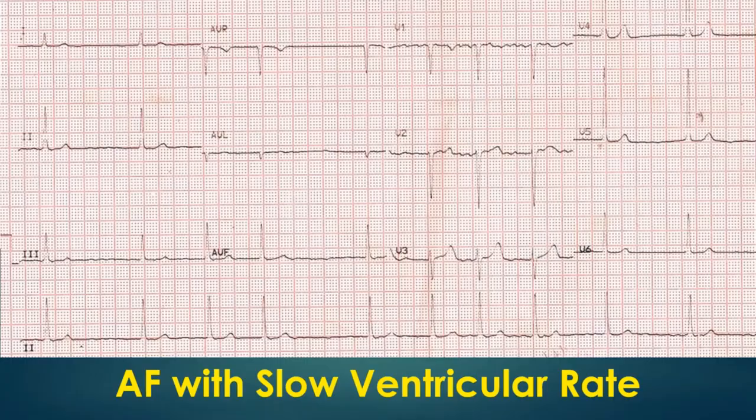Atrial fibrillation with slow ventricular rate. In this ECG, fine fibrillary waves are seen throughout the baseline indicating fine atrial fibrillation. When the fibrillary waves are more than 1 mm in amplitude, they can be considered as coarse atrial fibrillation.